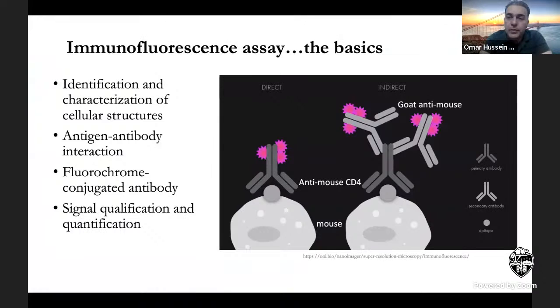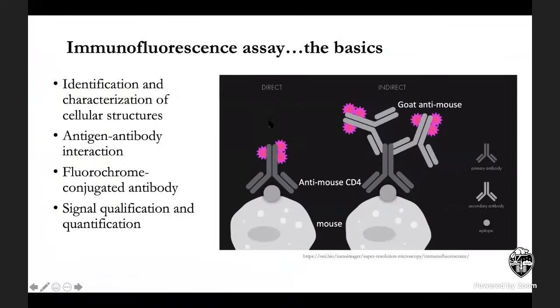Dr. Dalia has a question. Go ahead, Dr. Dalia. Sorry, Dr. Shakira, to follow up on this question about the differences between direct and indirect IFA. Sometimes we find non-specific signal. Where do you think the non-specific signals come from, the direct or indirect? And also for your experiment, did you get any non-specific signal?